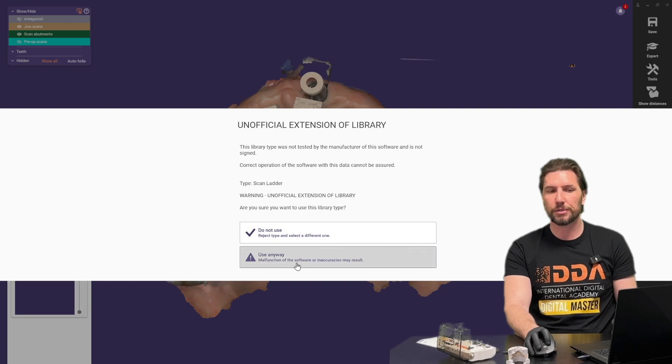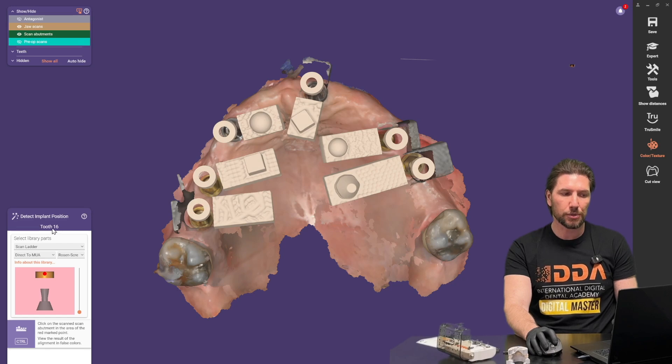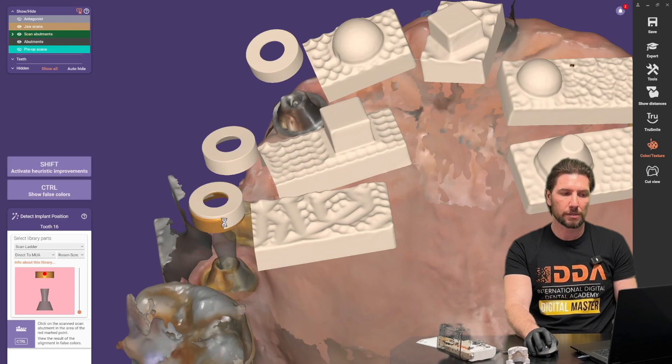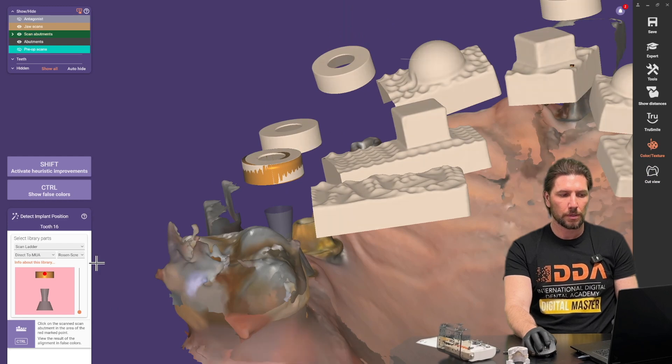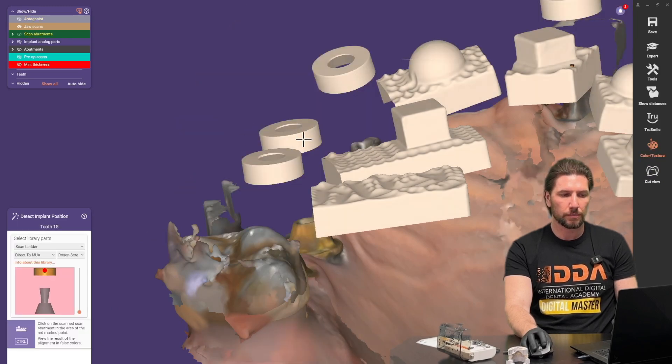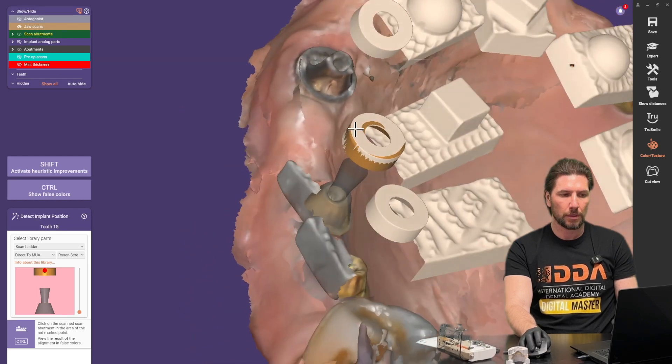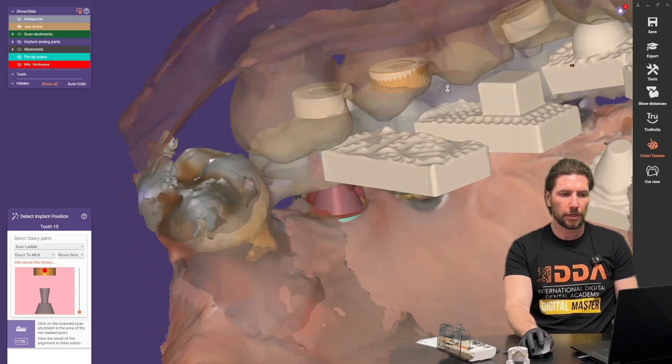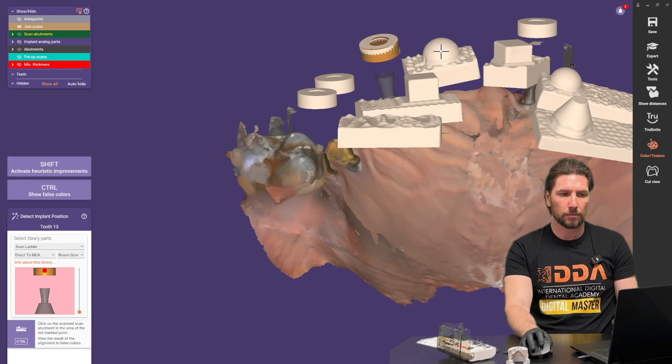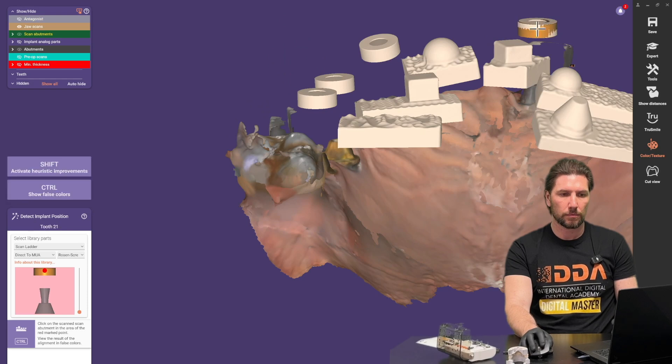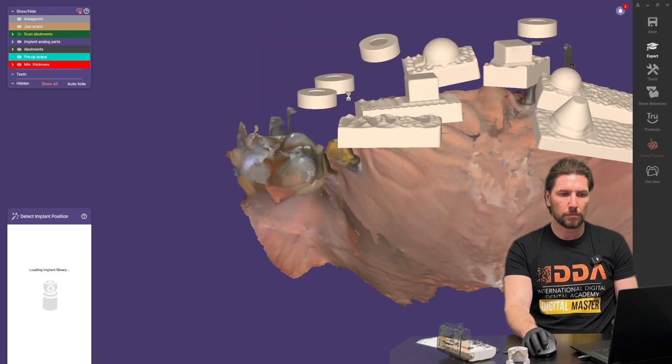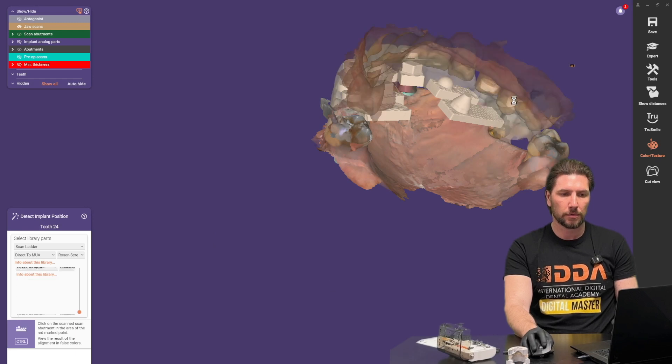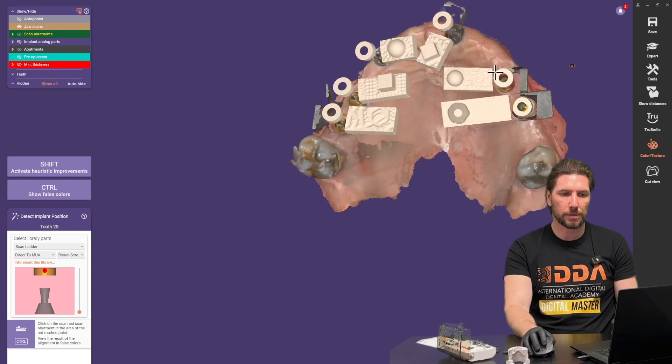If you get a warning don't worry about that use anyway and it tells you which tooth we're going to be aligning to so we've got tooth 16. So I'm going to click 16. So let's move on we're going to click the next and the next and the next and so on until we've gone through each one identifying the position of each one of those cylinders.